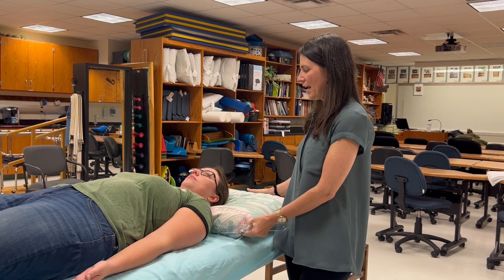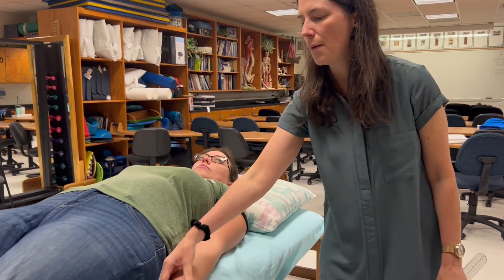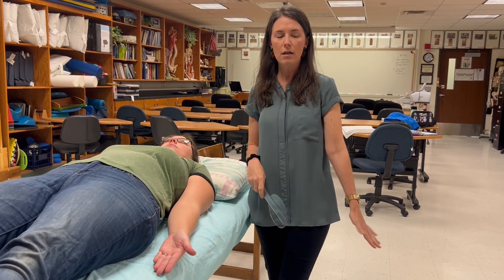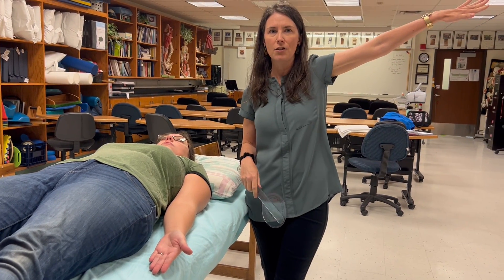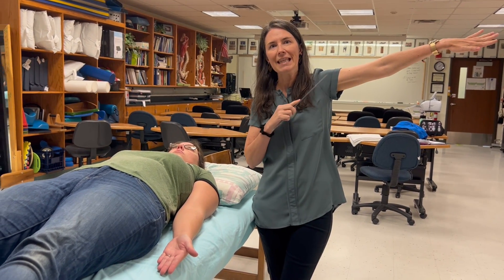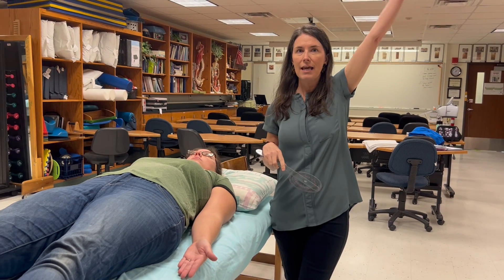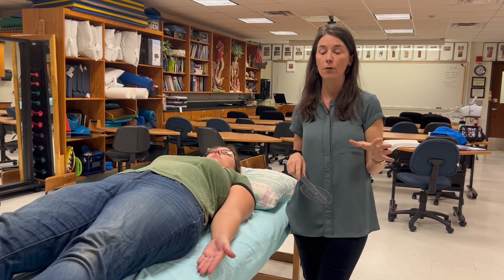The patient is supine and the patient position is palm up, because in order to fully abduct, we need to be fully externally rotated. If you're internally rotated or even in neutral and you try to abduct, you're only going to go so far because the greater tubercle is hitting the acromion process. But once we externally rotate and then abduct, that ensures that the greater tubercle is going to clear the acromion process and we can get full range.